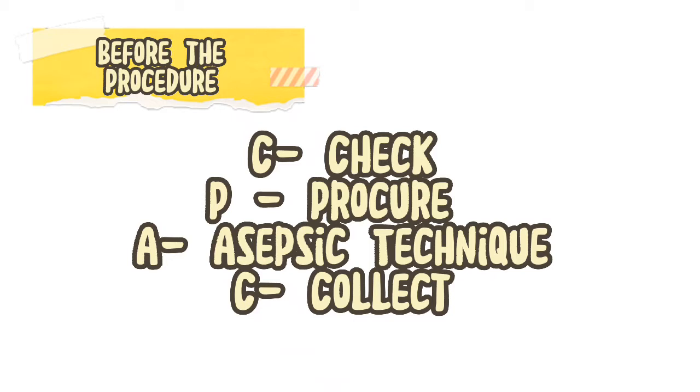P. Procure. Obtain signed informed consent if needed. Obtain assistance required from other healthcare personnel if needed. A. Aseptic technique. Wash hands and don procedure gloves if needed. C. Collect. Obtain essential equipment before starting and check that all equipment is functioning correctly.